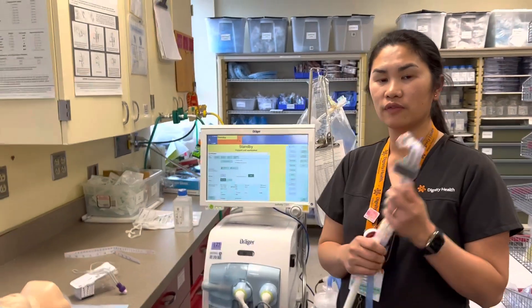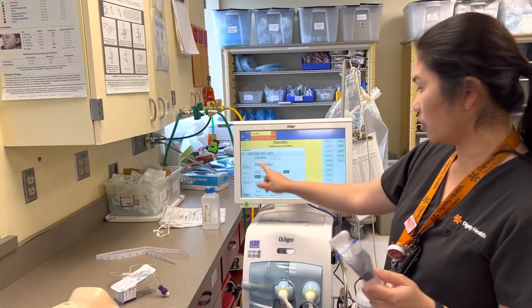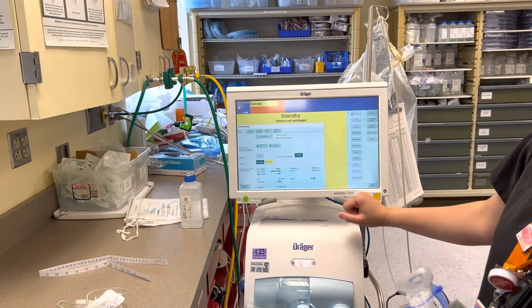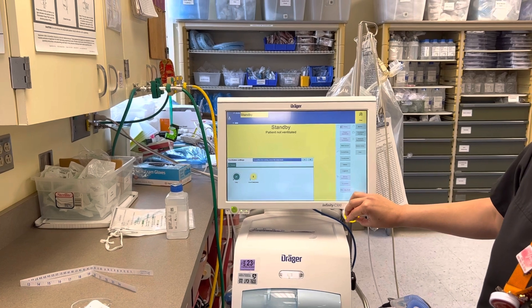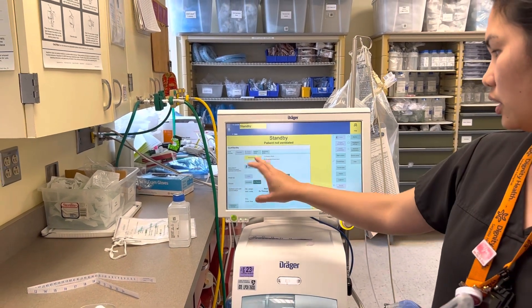I'm going to show you how to transition from CPAP to high flow. First, you're going to have to change the mode. Press O2 therapy. Set the flow that you need — two liters. Start ventilation.